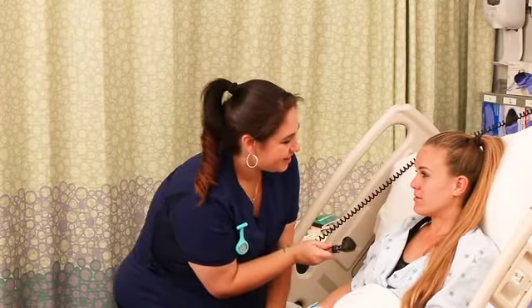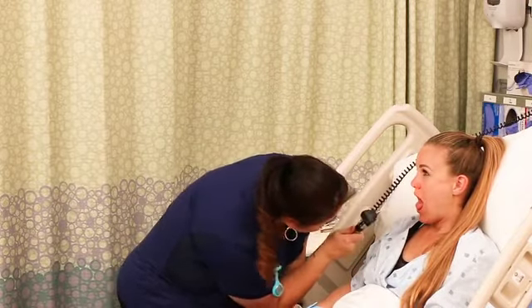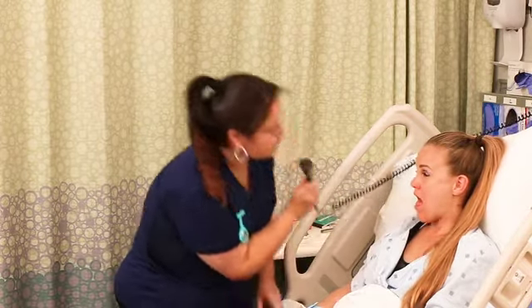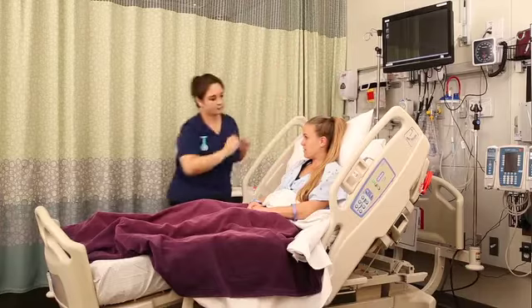You can also use this time to quickly inspect inside the patient's mouth. Just look at the mucous membranes. They should be pink and moist with no lesions or ulcerations. Look for any white patches that could indicate thrush. Now you can put the otoscope away and inspect externally.